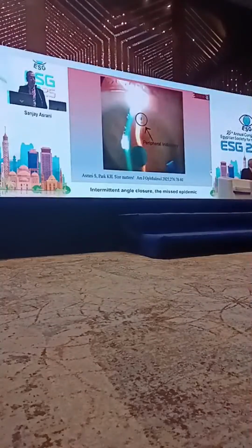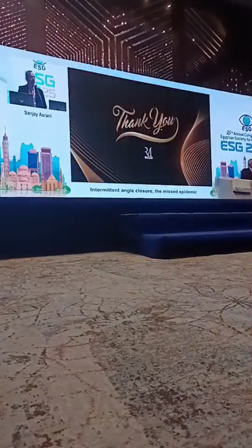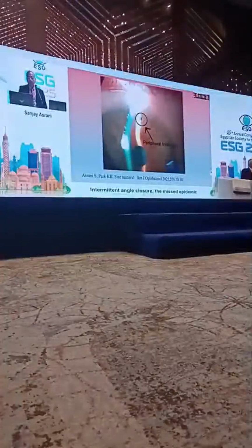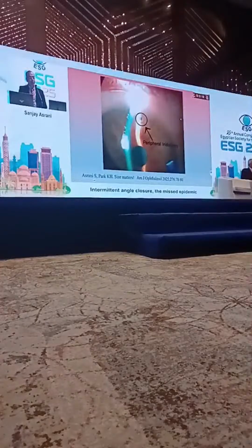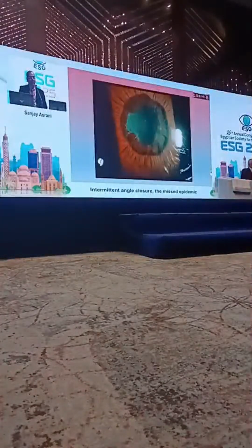Also, iridotomy size is critical. If you don't make the iridotomy a minimum of 250 microns, it is not effective. So therefore, make sure that the iridotomy is not this small. It has to be a minimum of 250, and in diabetics and in uveitis, 350 microns. Creeping angle closure, posterior pushing mechanisms.